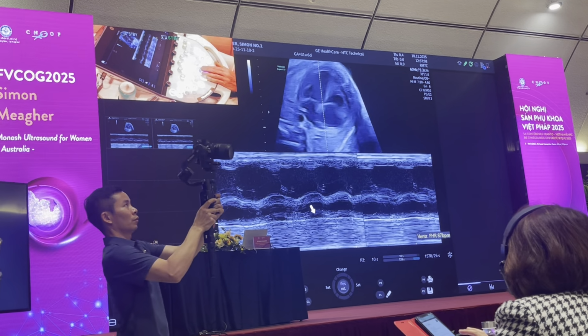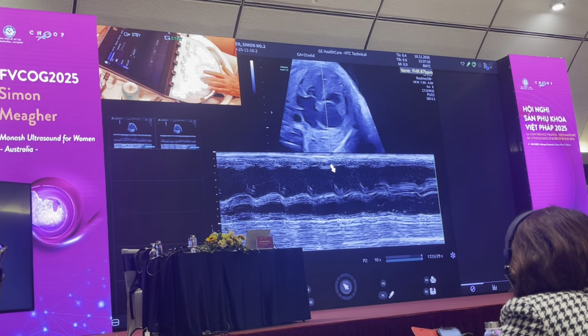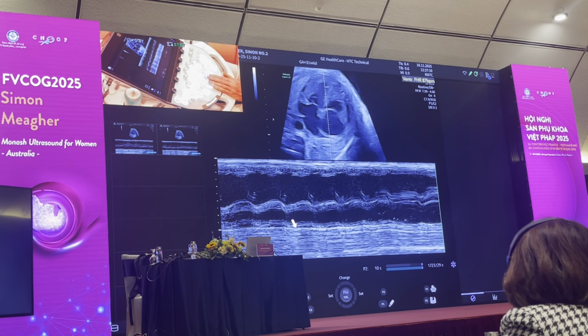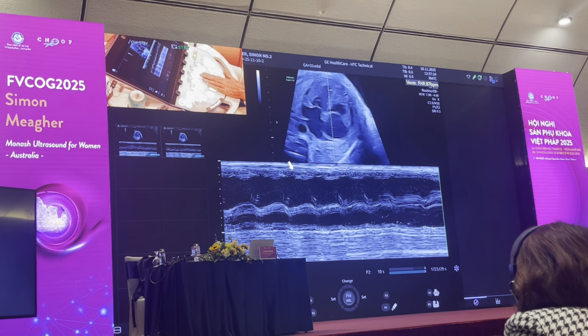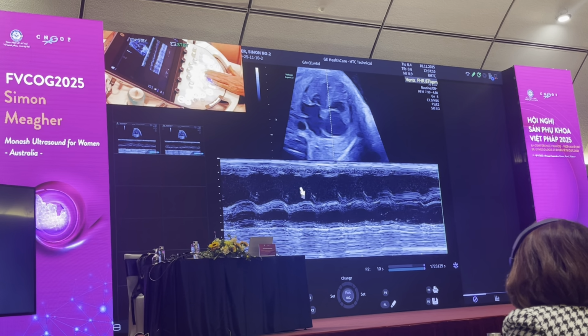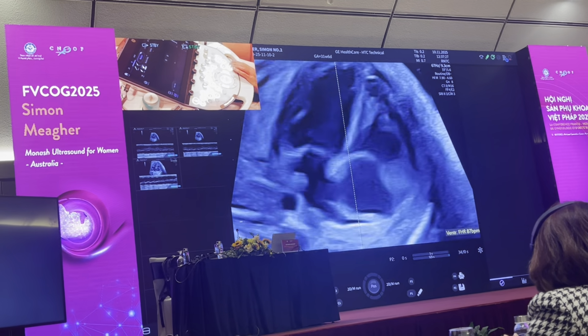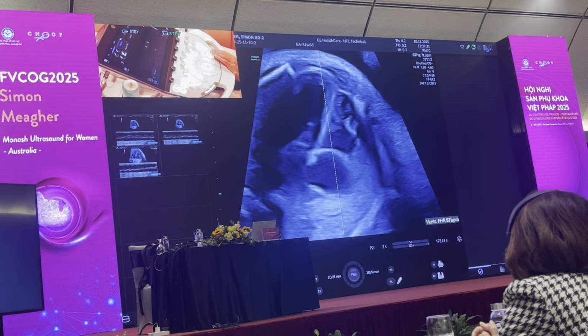So you're looking to see the transmitted pulsations from the ventricle. You're looking at the ventricular motion, and you're looking at the corresponding atrial motion. The atrium sends off an electrical impulse, and then it goes down to the ventricle, and the ventricle contracts. So from the right atrium to the left ventricle, this is the best place to take your M-mode when doing a rhythm disturbance evaluation.